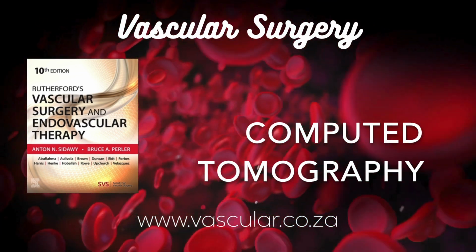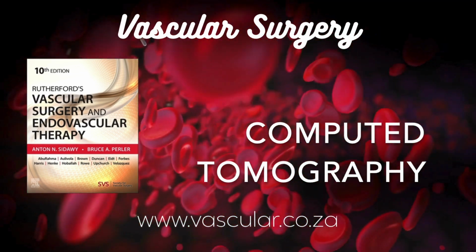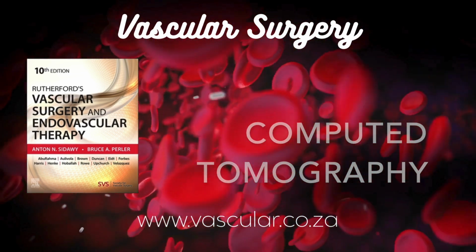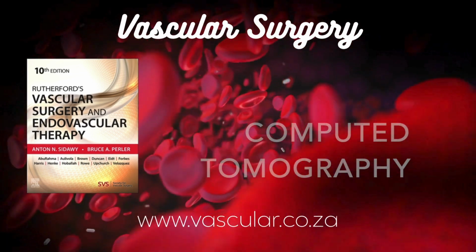One interesting thing is that if you lower the energy of the X-ray beam, the kVp setting we talked about, it can actually make the iodine appear even denser, enhance its visibility without changing the actual amount injected. So that's another parameter they can tweak. Okay, let's shift gears slightly. Before the scan even starts, there's a whole bunch of settings that need to be programmed in, right?